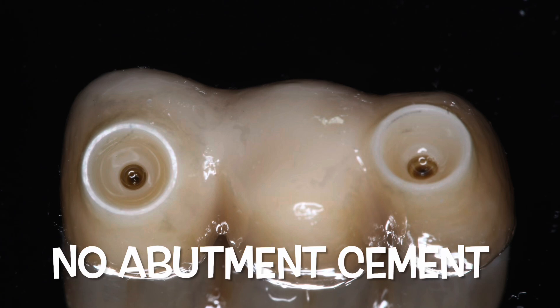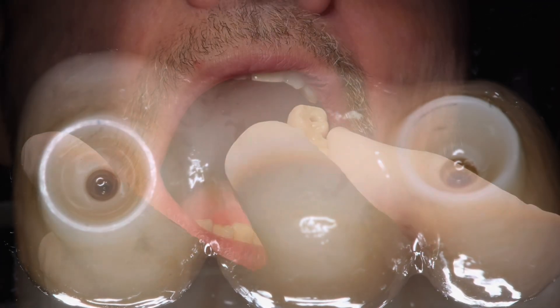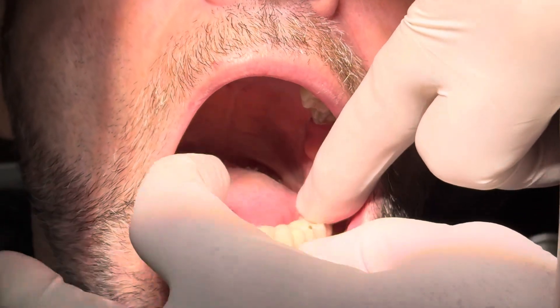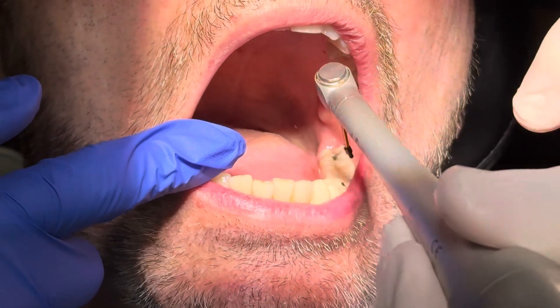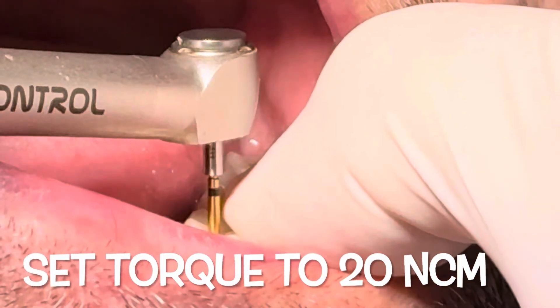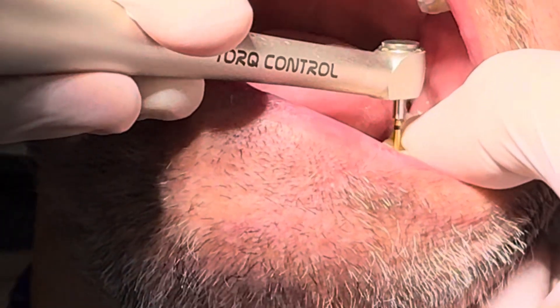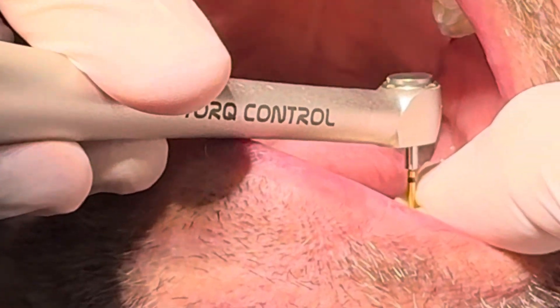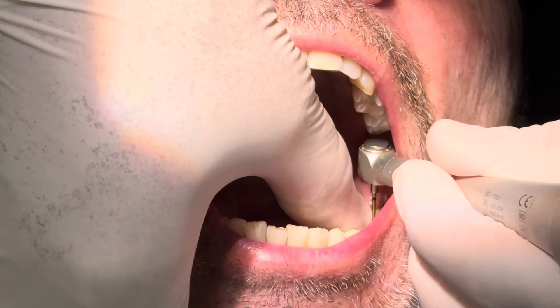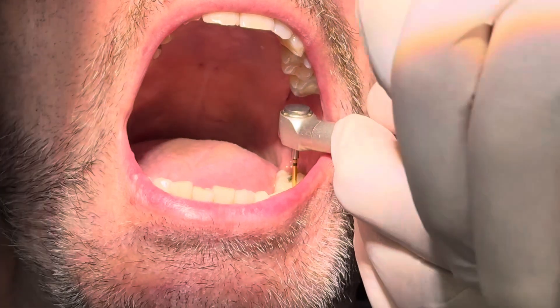Looking at the intaglio surface again, you can see it has these rings — these are important because the angled screw channels on these screws allow you to correct if the implant is slightly off. When you go in with the screw, hold the bridge down with one hand and put the screwdriver in with the other and tighten the screw. The OmniGrip mini screw will start to lock the bridge into position.